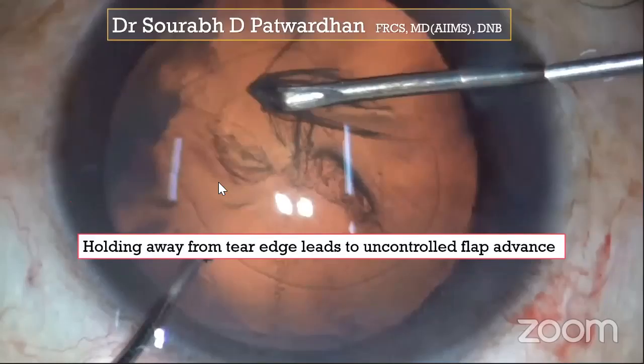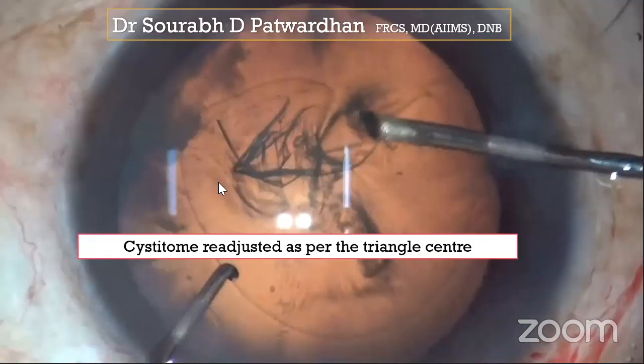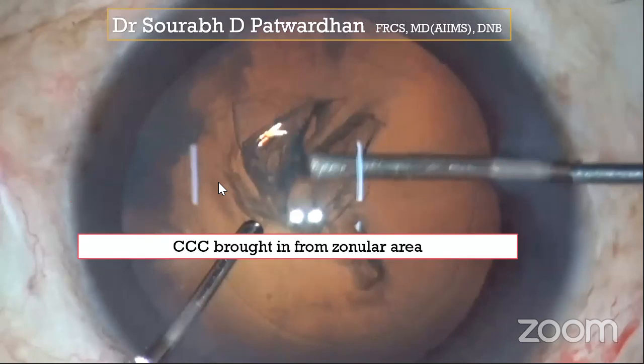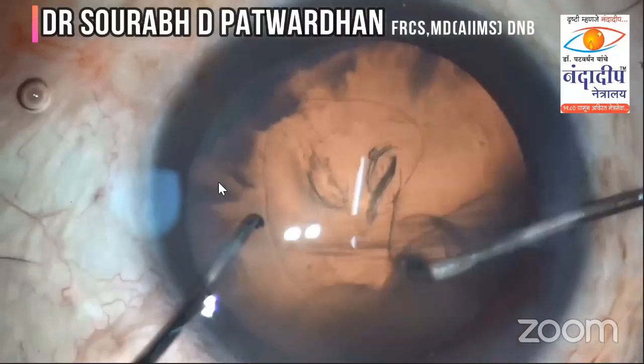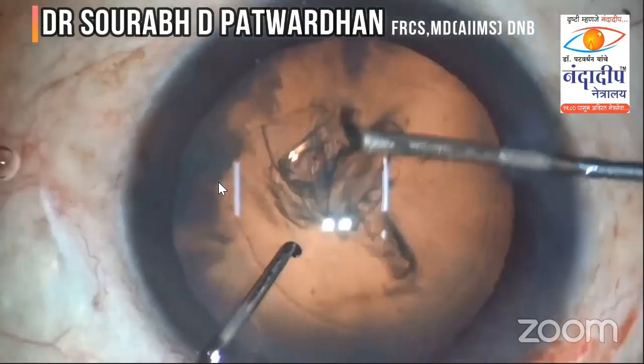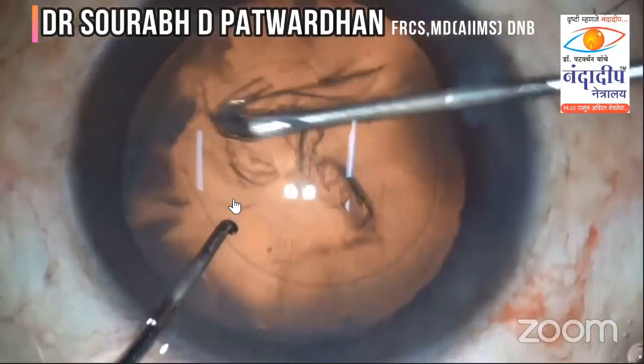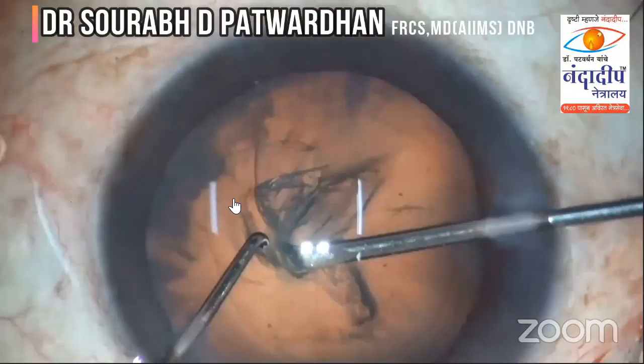If you hold far away from this point, you get uncontrolled extension of the flap. Like in this case, the surgeon is trying to hold the capsule far away from the center of the triangle, and he will get extension of the CCC like this. Now, to control it, you have to again adjust your cystitome to the center of the triangle and then pull it back. So let's see this in the video. As you can see, the surgeon has not changed the position of the cystitome, and that led to outward movement of the CCC. Watch here. He's trying to continue holding the flap from away, and the CCC tries to go out.